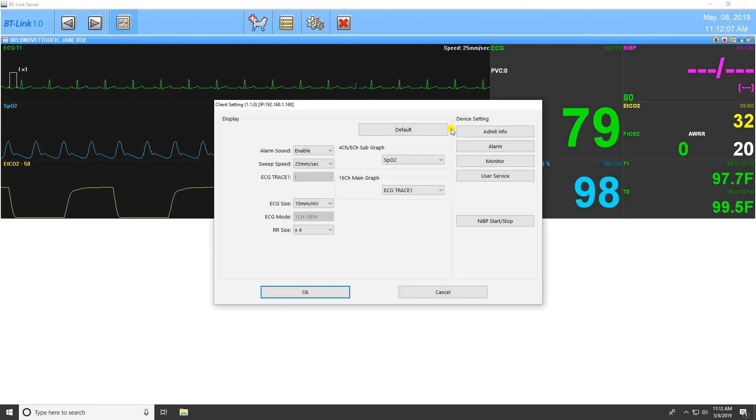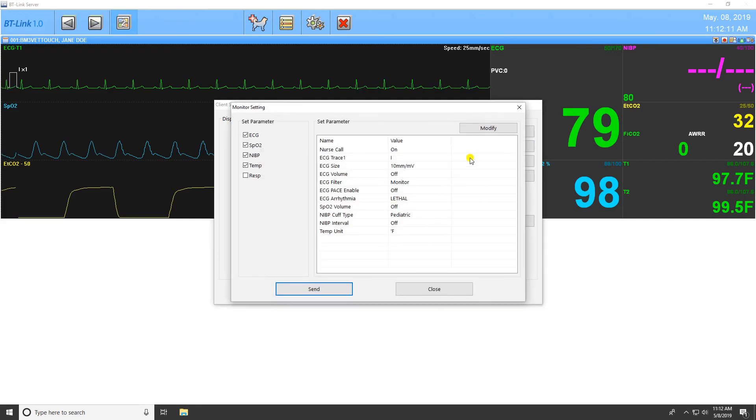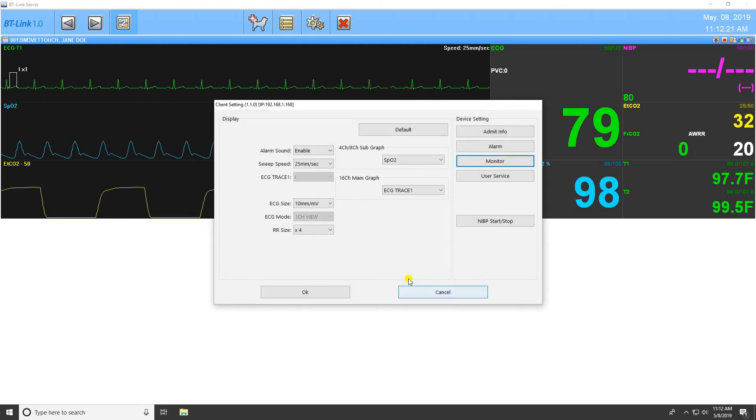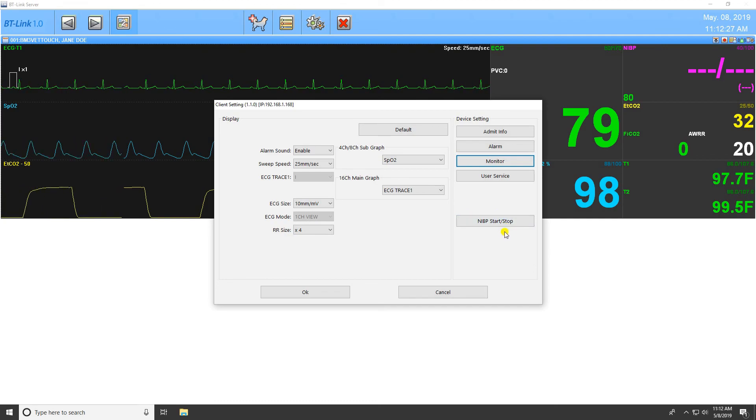The options on the right of the display setting allow you to change the data on the patient monitor itself. Any data that is changed in these four settings can be sent to the monitor directly, and you will see the changes reflected on the monitor once you hit Send and confirm your choice. This menu also allows the user to start or stop the non-invasive blood pressure cuff on the machine directly from the program.